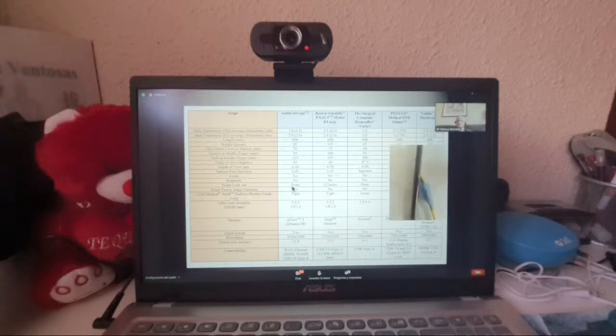I'll show you this balloon issue in a minute. Actually, I'll just show you now. So this is, you know, this Cook Arndt balloon blocker. You might use this in patients who have hemoptysis, and it's got a little lasso you put around the scope.